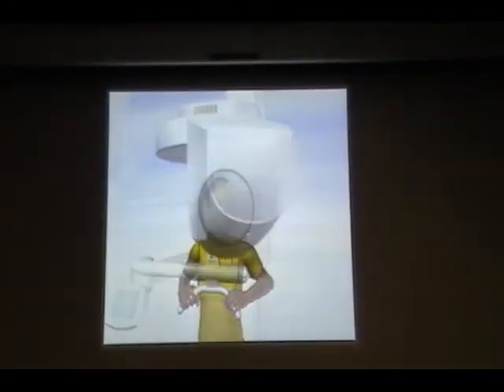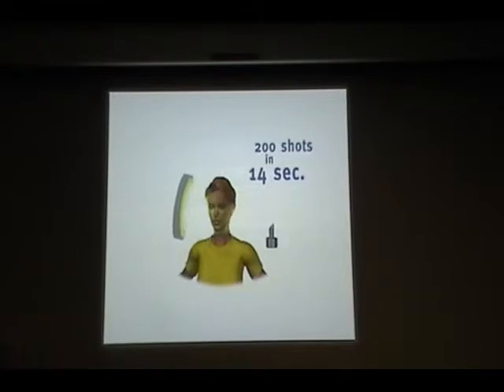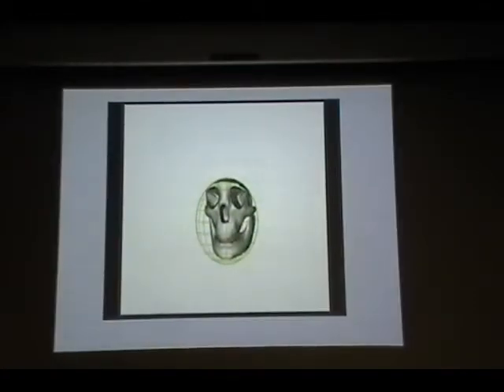So this is one brand of machine, Sirona. To your point, if the caries is on the facial or on the lingual side and you're shooting x-rays this way, how can you tell whether it's on the facial or the lingual? That's one of the reasons we don't use panoramic radiographs to identify dental caries. We look at gross abnormalities, like an impaction or a fracture. So when I taught the panoramic radiograph, I never discussed dental caries. It's hard and challenging because we don't know what's inside.